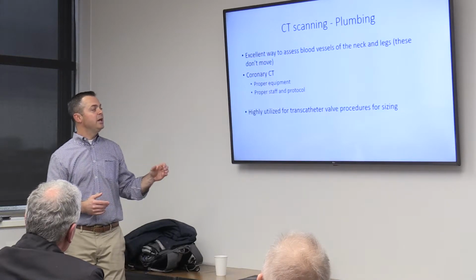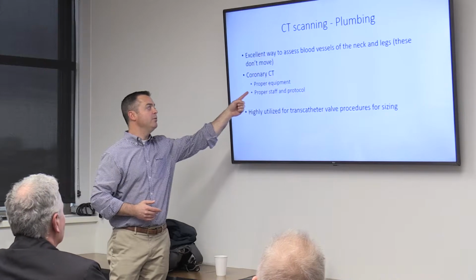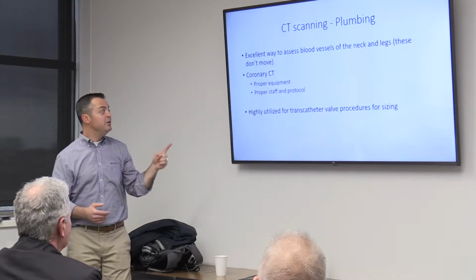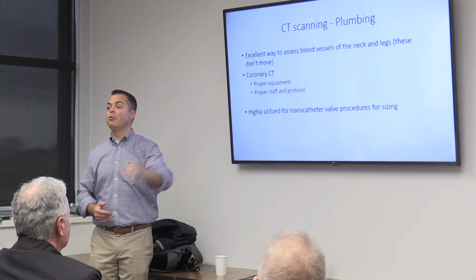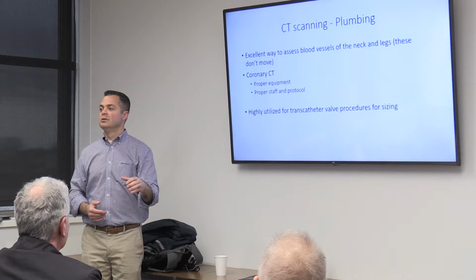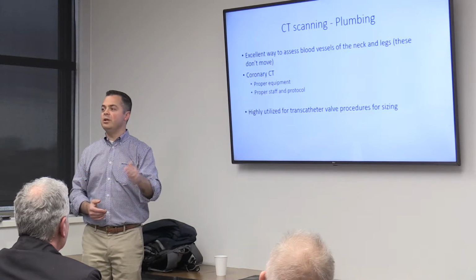So, I mean, you can get really exquisite detail, but again, you need proper equipment, and what I mean by that, you need a fast CT scan, okay? And you need the proper staff, the proper protocol. So again, the CT techs that work here, this is what they do. They do these kinds of things every day.